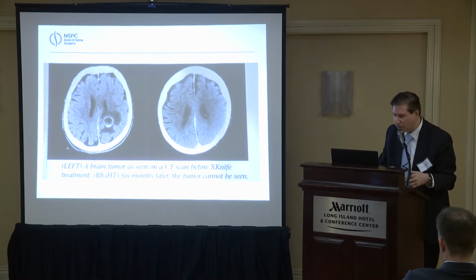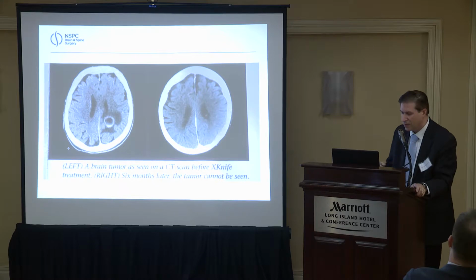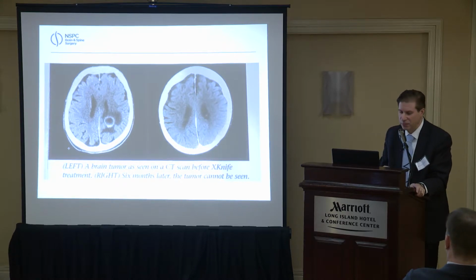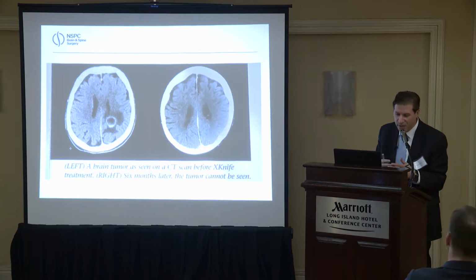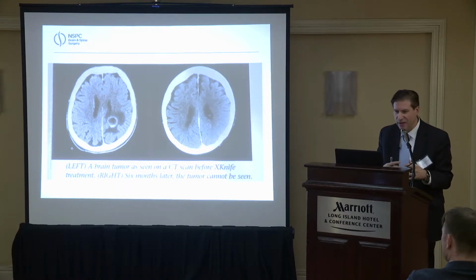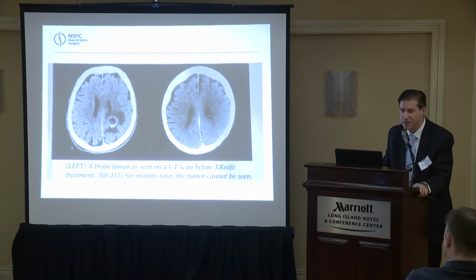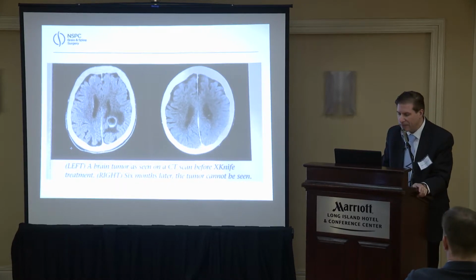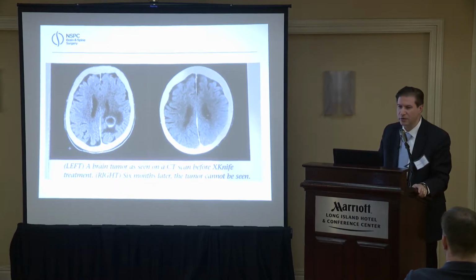I think if there's 50 brain metastases, whole brain is still good, but data really suggests that people do just as well, and it's a single treatment. They can get back to their chemotherapy. They don't have the debilitating long-term effects of whole brain, which can include memory loss and other problems. It takes a month to do whole brain. So for most brain metastases, I'm doing radiosurgery as treatment of choice.